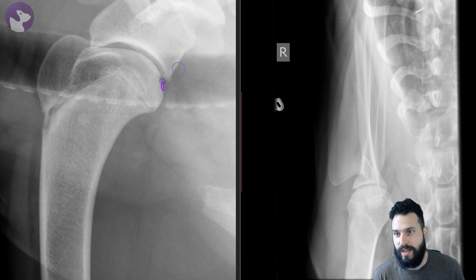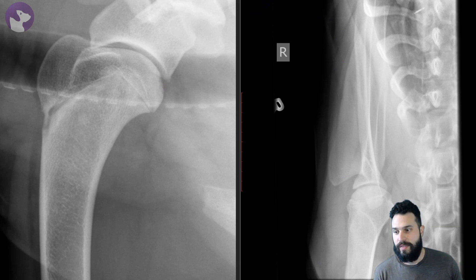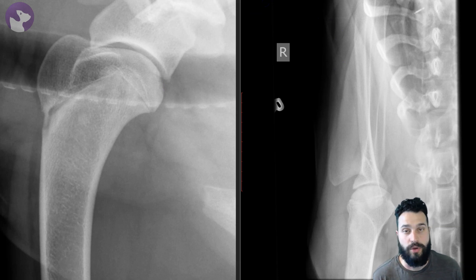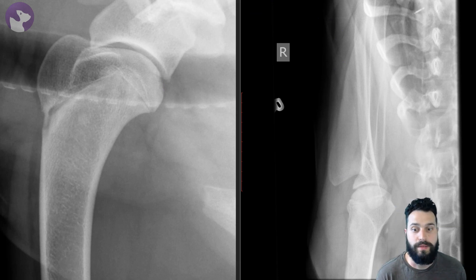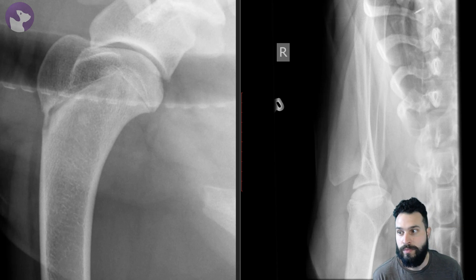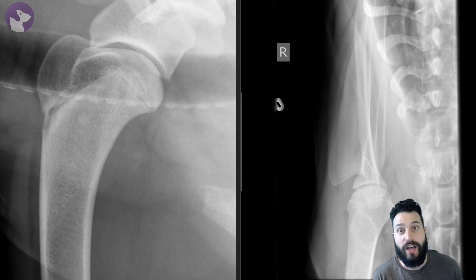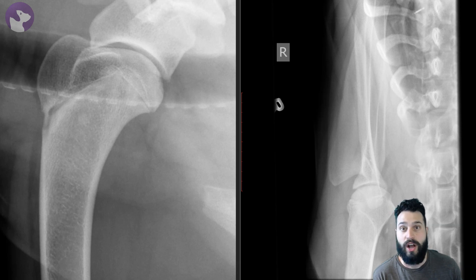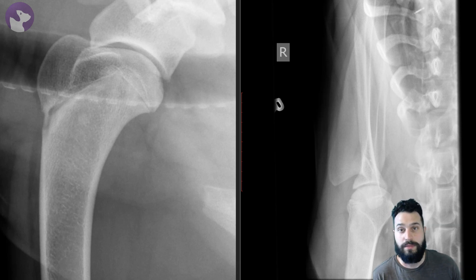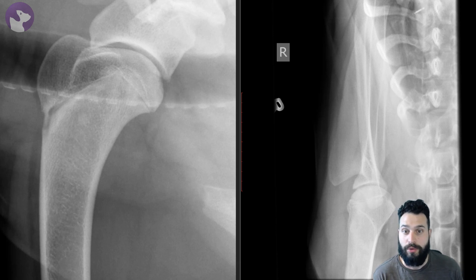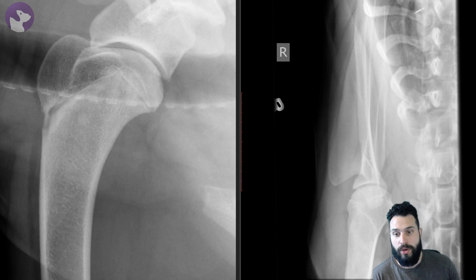There's a very tiny, faint little fragment associated with it that's kind of separated by lucency. This is going to be something that a surgeon can go in and debride, making this dog feel a lot better. An important thing is going to be to image the other limb to make sure the OCD lesion is not on the contralateral limb as well.